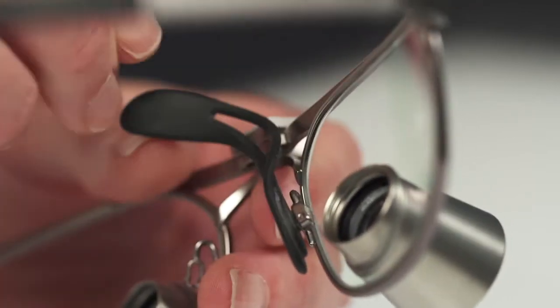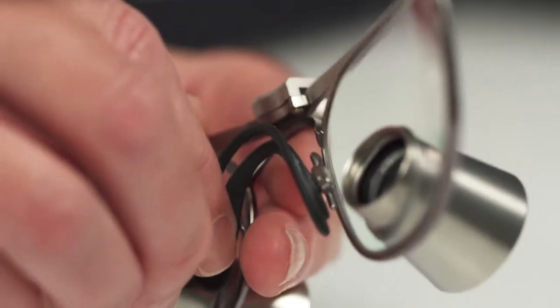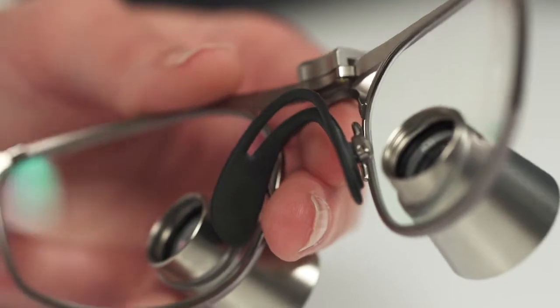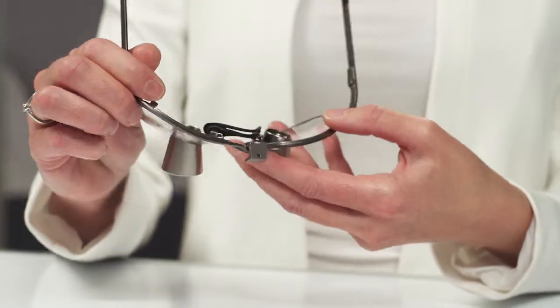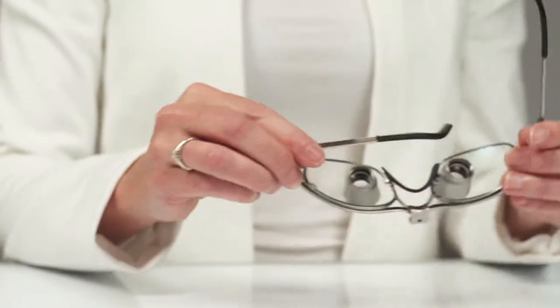Pop the clips into the nose pad arms. Your local optometrist can also help you replace your nose pad. Contact your local ExamVision dealer if you have any queries.